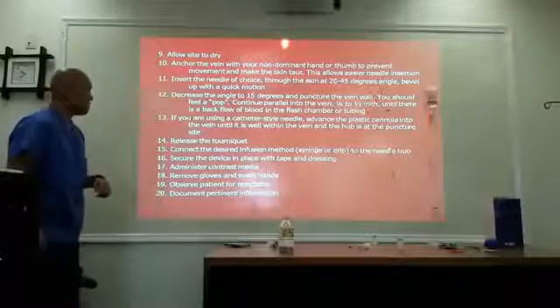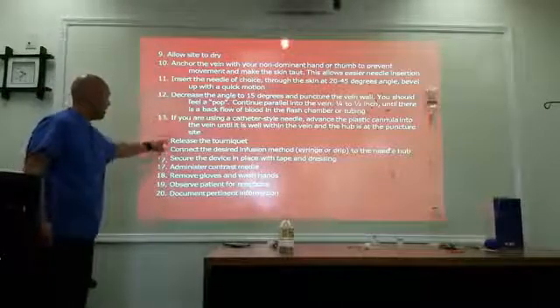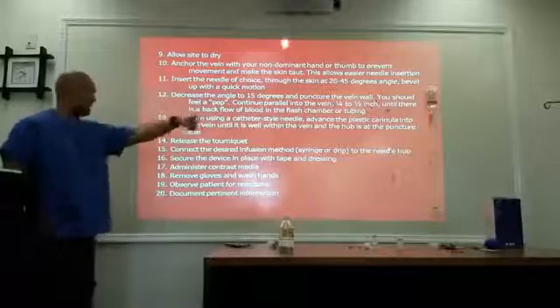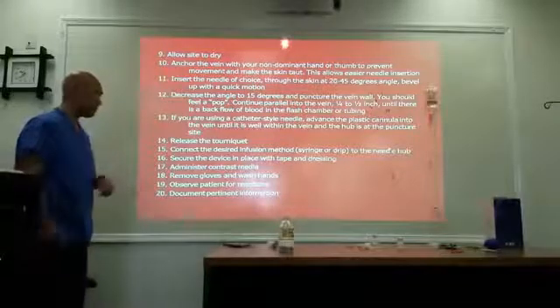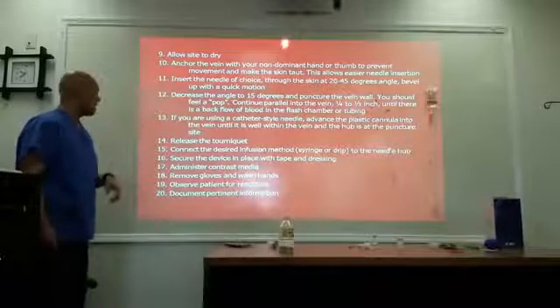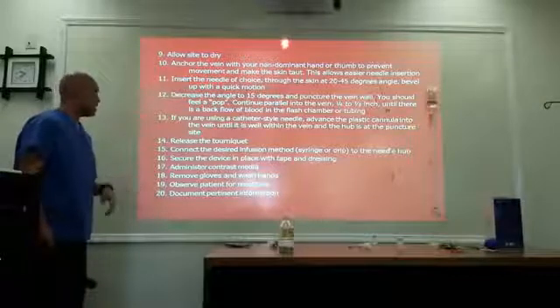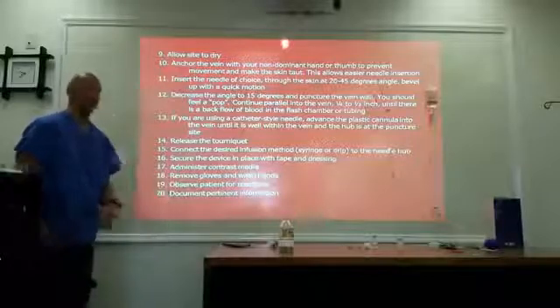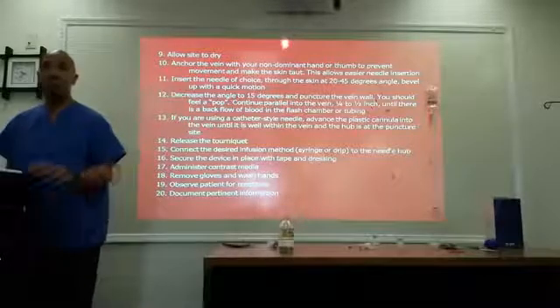I'm going to skip this for a little bit. Once you get access, release the tourniquet, connect the desired infusion method, secure the device in place with tape, administer the contrast, and then you're done. Go wash your hands and do your nursing stuff.